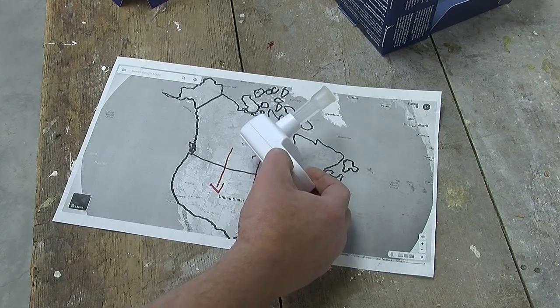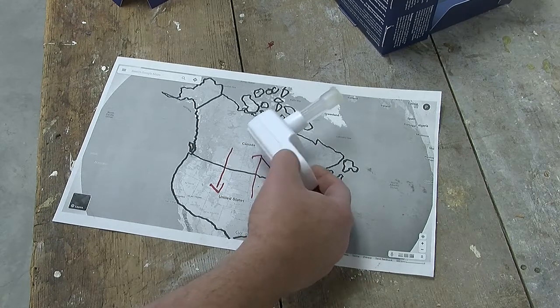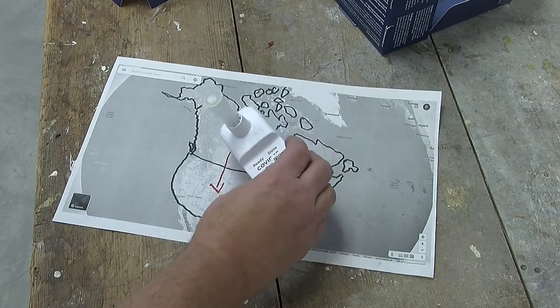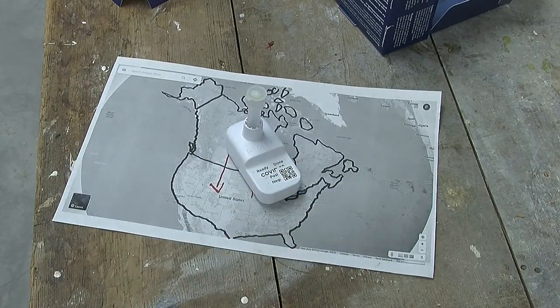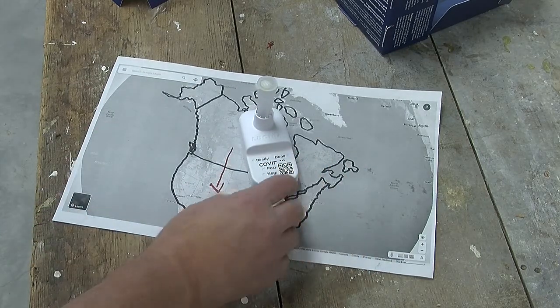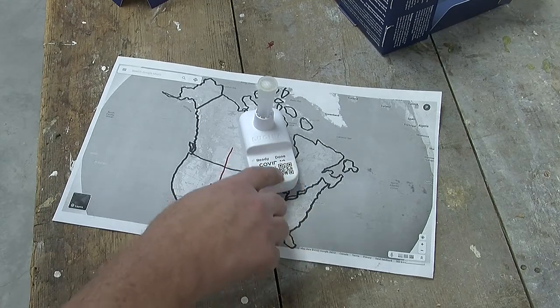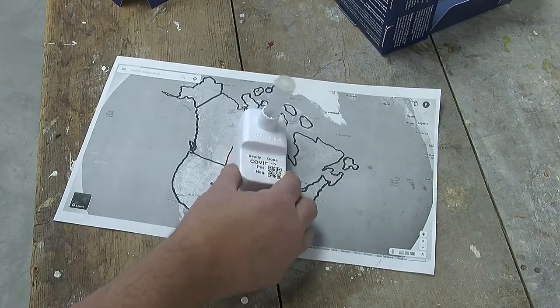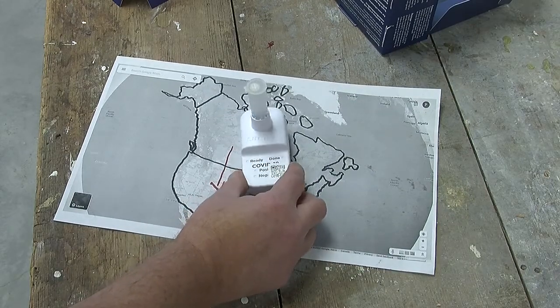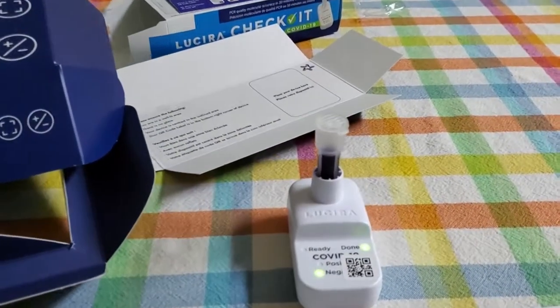The more well-known PCR tests require multiple heat-cold cycles. This thing requires one, and that's how they were able to make this nice little package. And again, you can see what the Switch Health Company did was provide these little one-time use stickers to validate the test unit as being the one that you originally used when you submit the results.